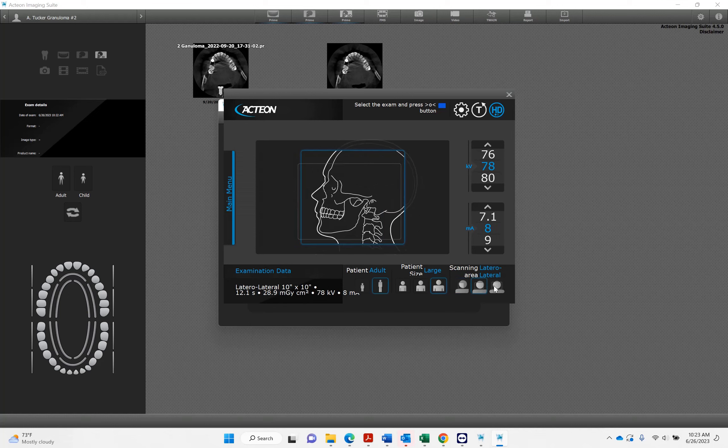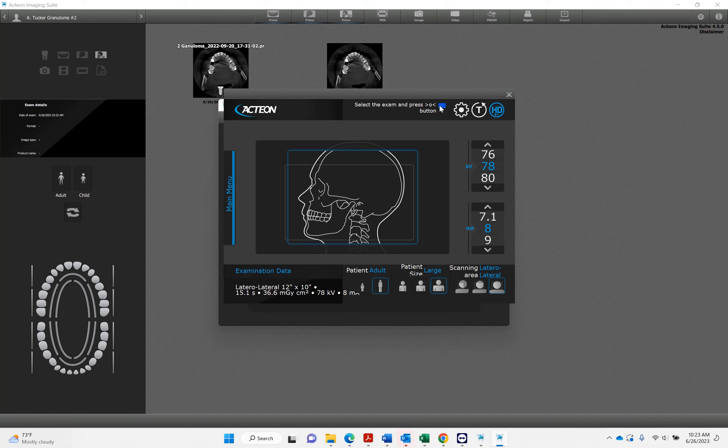The doctor will tell you which to select. You're just going to hit the zero button. The sensor is going to tell you to remove the sensor. You're going to pull out the temple supports and the chin rest, then line the patient up. Then you'll take the sensor off the U-arm and attach it to the CEPH.